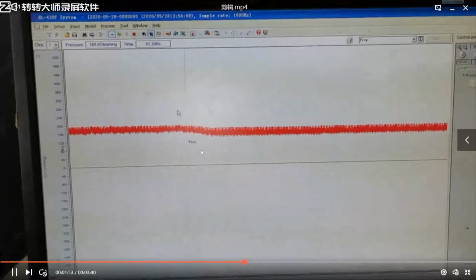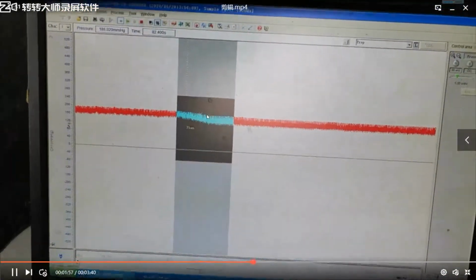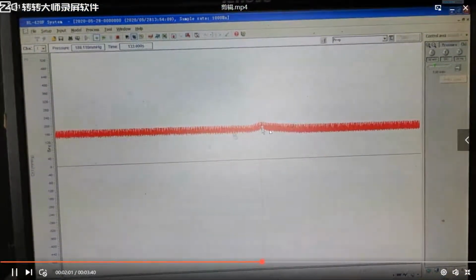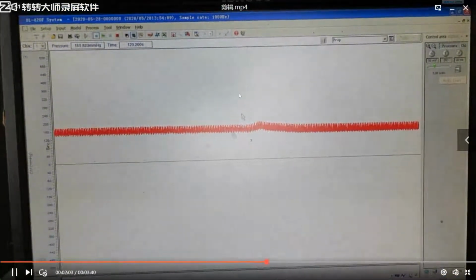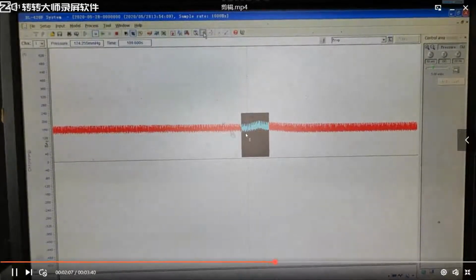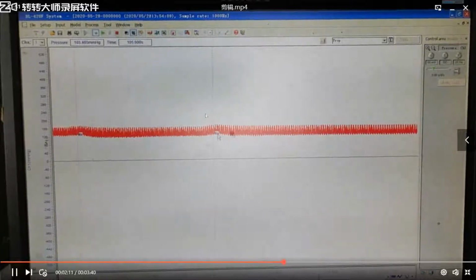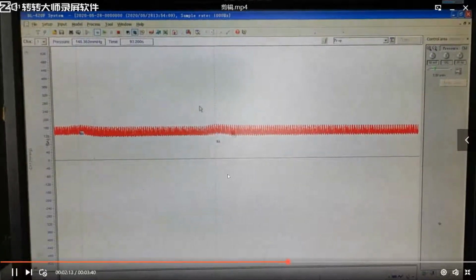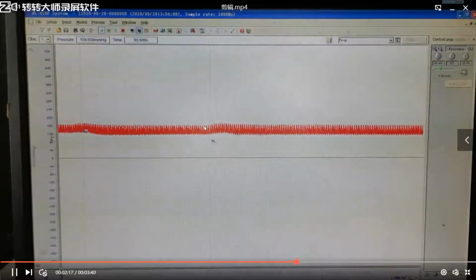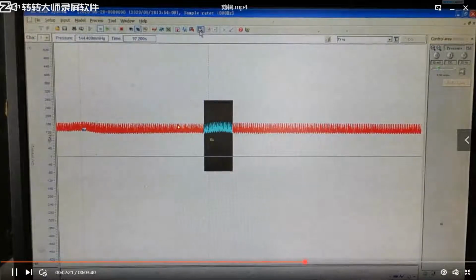And we give phentolamine, the alpha receptor blocker. Okay, it reduces blood pressure. We need several curves. And we give adrenaline again. Data cut. A little increased blood pressure. And then we give noradrenaline again, a little increased blood pressure. Data cut.